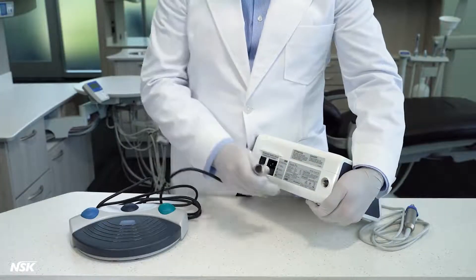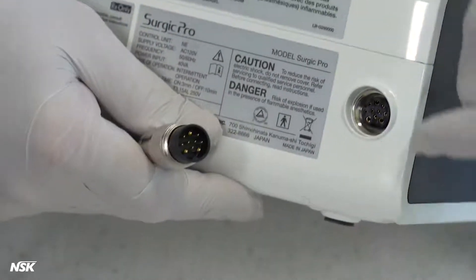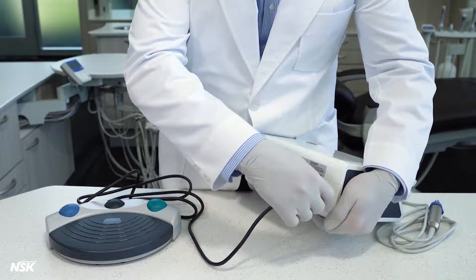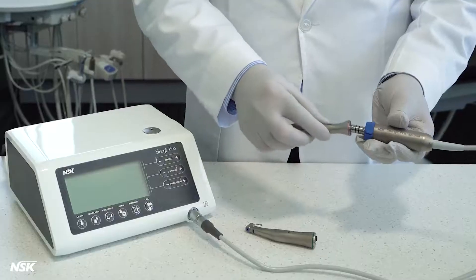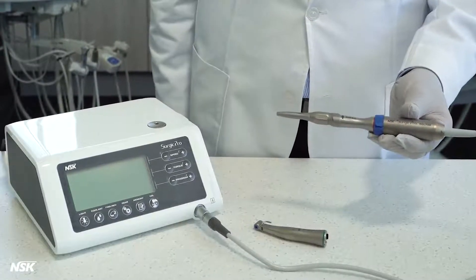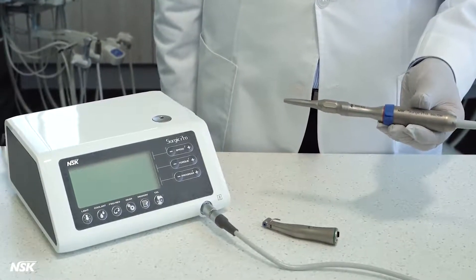Next, connect the foot control cord using the guide pin located at the bottom of the connector, which is at the back of the unit. Tighten the lock nut to secure the connection. Insert the attachment into the motor and twist until it locks in place. Non-optic attachments do not need to be twisted to be locked in; however, microsurgery handpieces will need to be twisted on non-optic motors to be locked in place.